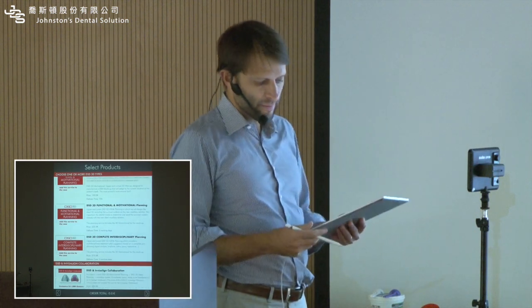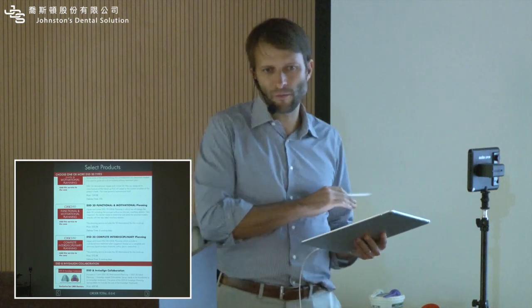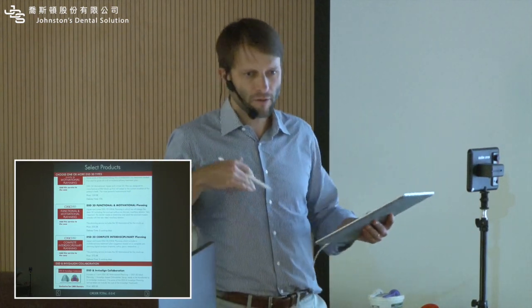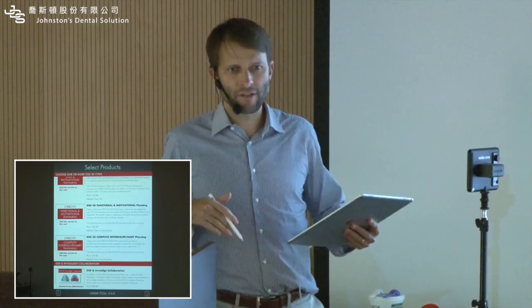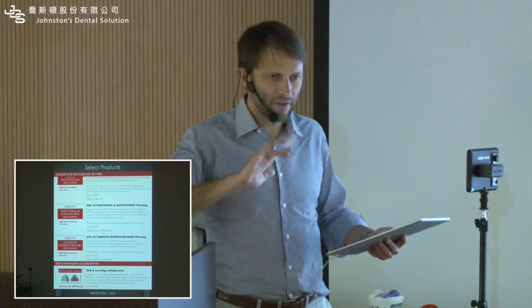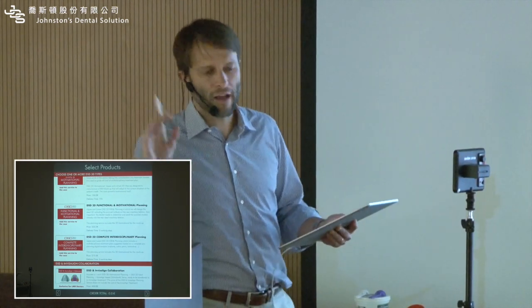3D complete interdisciplinary is if the dentist wants us to simulate all the possible solutions. Implants, ortho, crown lengthening, perio, orthognathic, whatever is needed, restorative, bite change, function, everything. Okay?